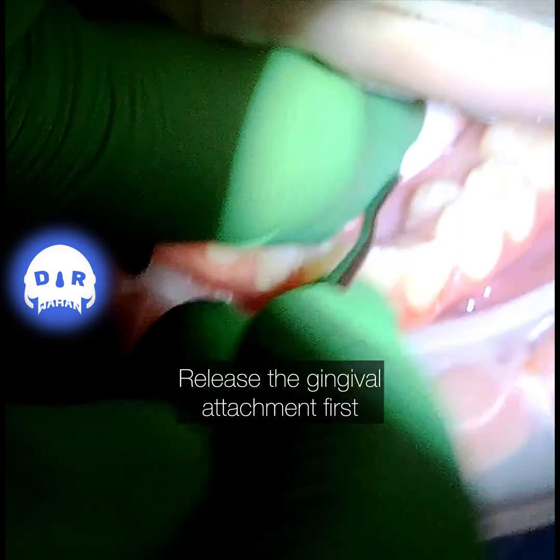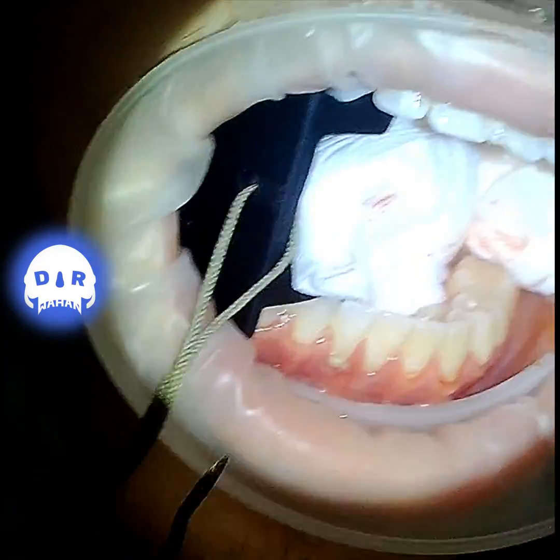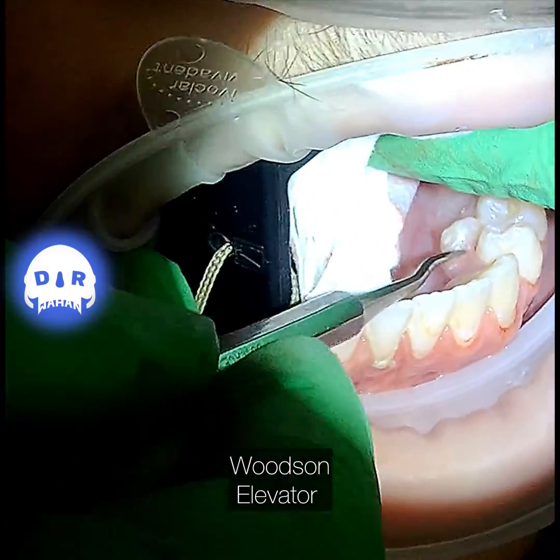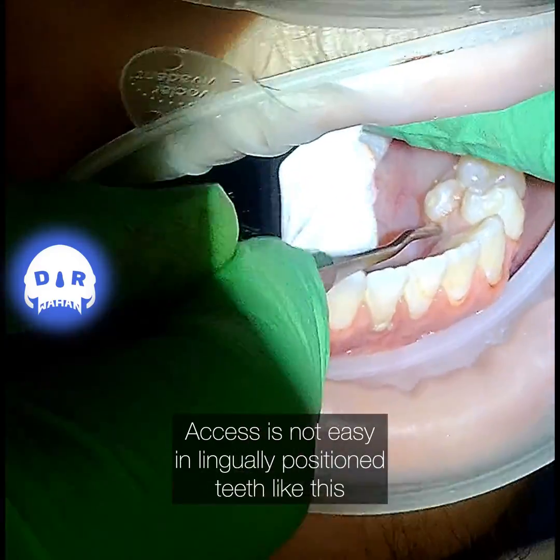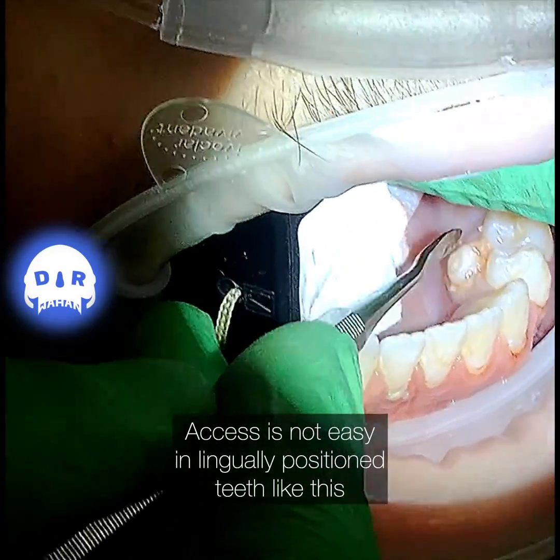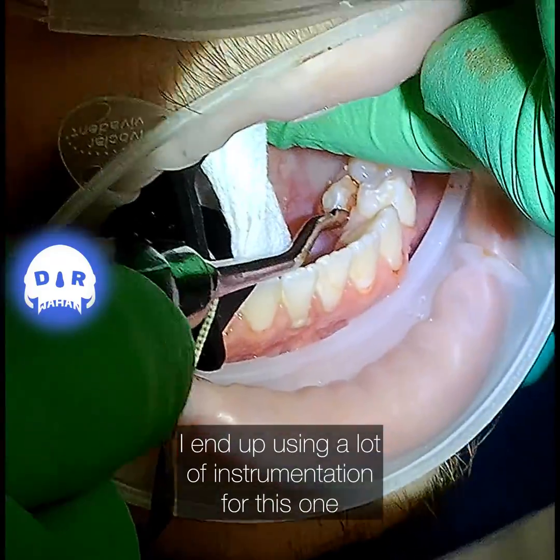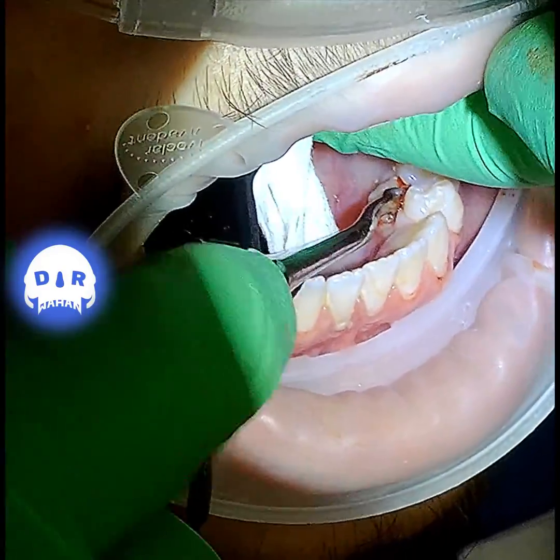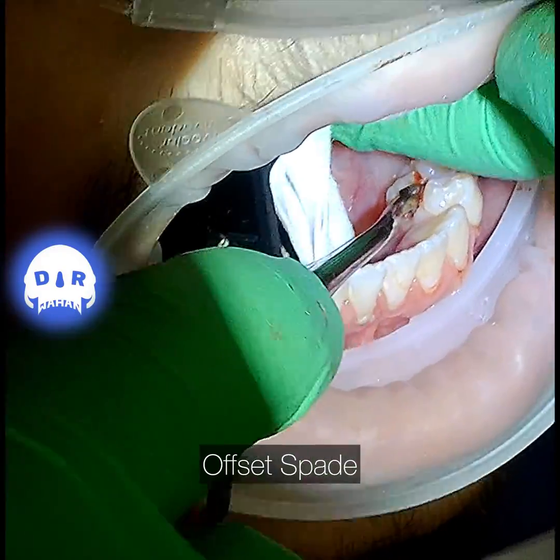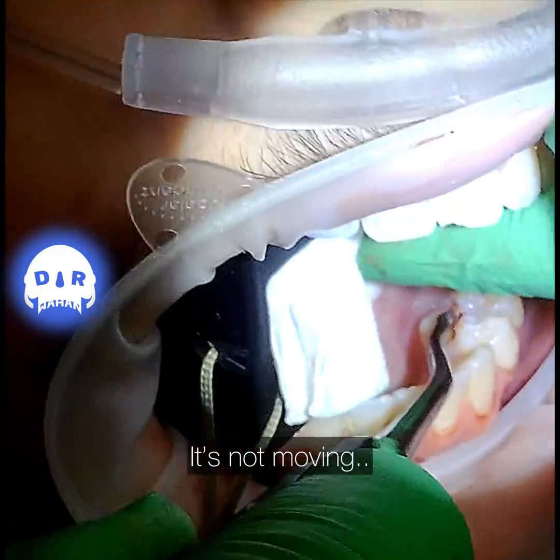This is a lingually positioned extra tooth that we're going to remove. The patient is actually in their late 20s to early 30s, so the tooth is pretty solidly in position. Hard to see from the films, but the root of this tooth is actually kind of between some of the roots of the permanent teeth next to it and right up against them.